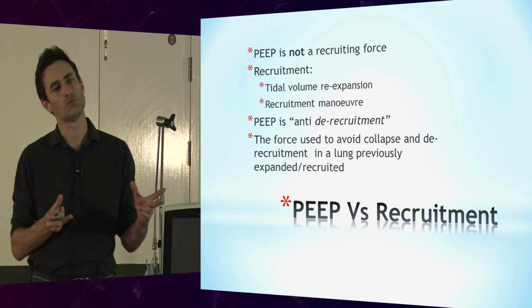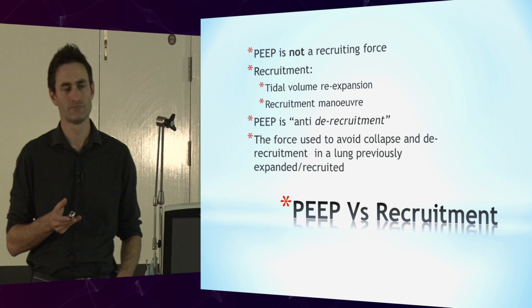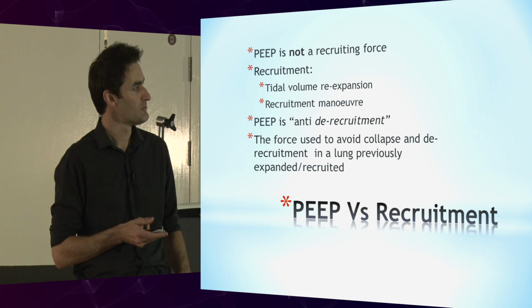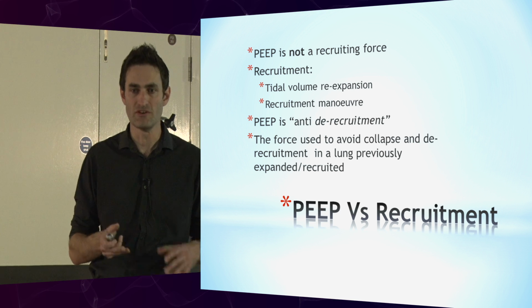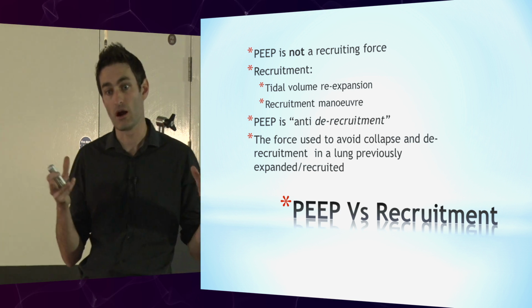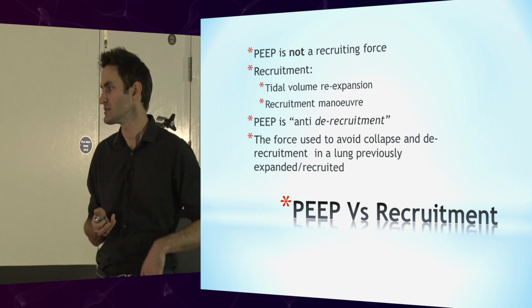But just by increasing your PEEP, you will not adequately recruit lung. There will be some degree of recruitment, of course. But what you need to do is a dedicated recruitment manoeuvre to actively open the lung up properly and effectively, and then keep it open by utilising PEEP.